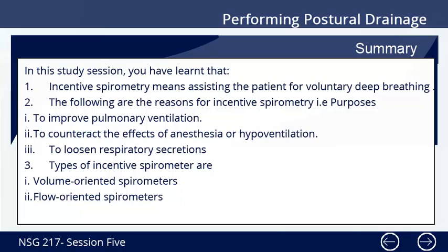2. The following are the reasons for incentive spirometry, that is, purposes. 1. To improve pulmonary ventilation. 2. To counteract the effects of anesthesia or hypoventilation. And 3. To loosen respiratory secretions. 3. Types of incentive spirometer are 1. Volume-oriented spirometers and 2. flow-oriented spirometers.